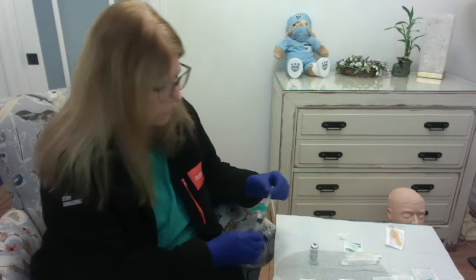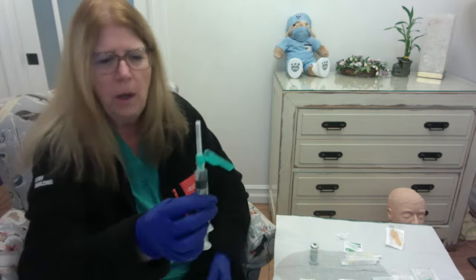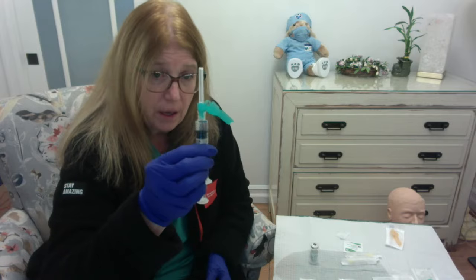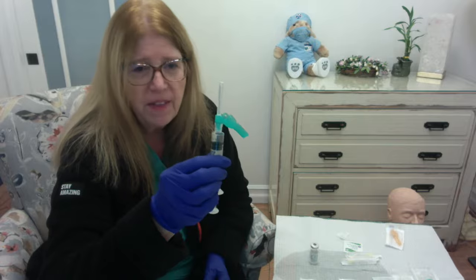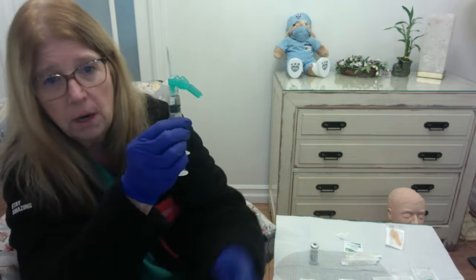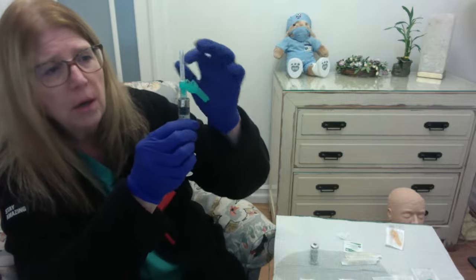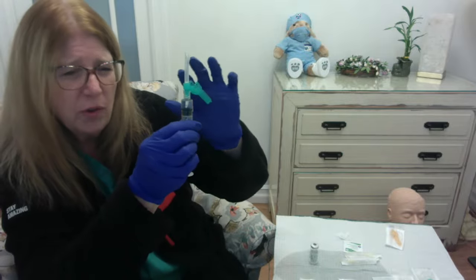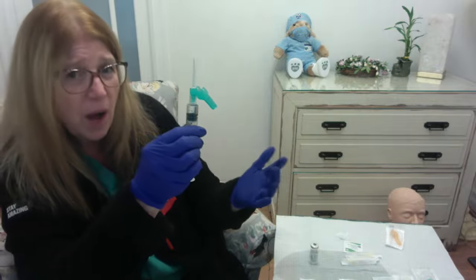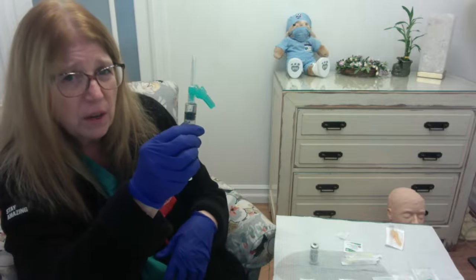Now, we have one of 2 options with this. Perhaps this medication is now going to get injected into a patient. If that were the case, I would have to change this needle, right? You have to change the needle because we've already put this needle in and out of vials multiple times, and believe it or not, that damages the integrity of the needle.